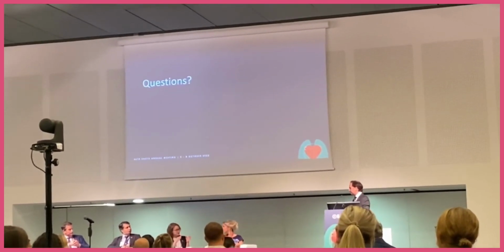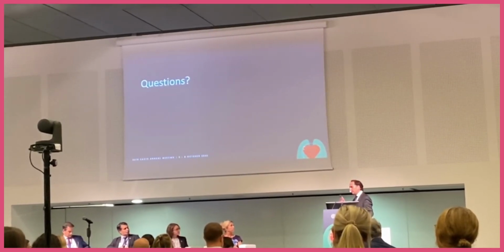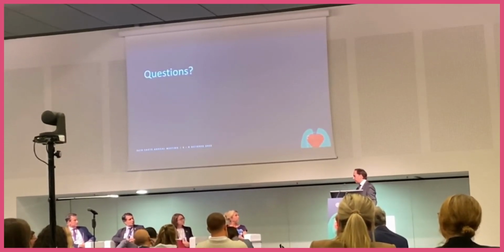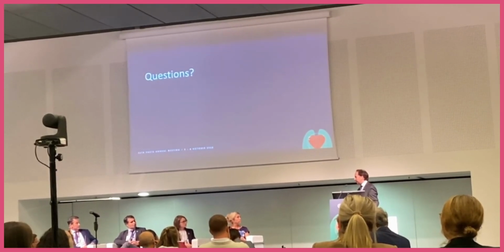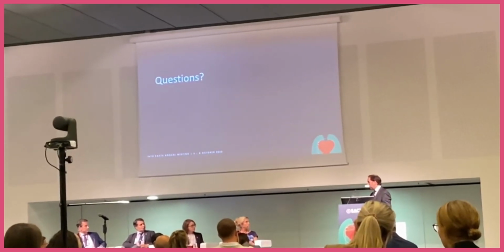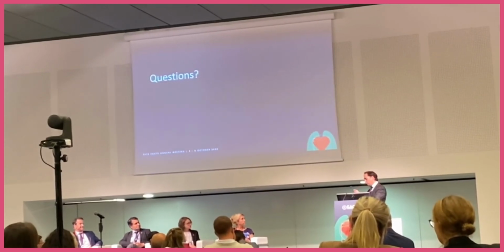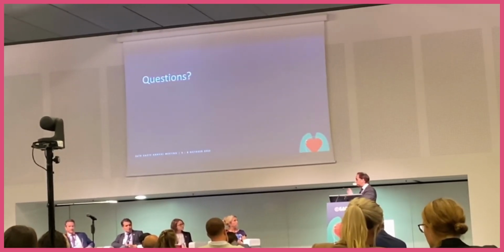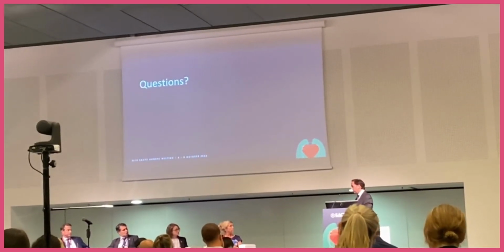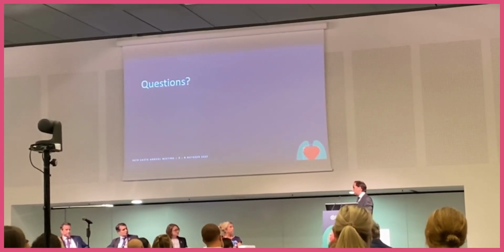Is there variability in the size, or is there a minimum vessel size? Yeah, that's a very good question. So in this trial, we started with a small clip. It's actually aimed for diameters of 1.2 to 1.7 millimeters. That's also why we targeted either diagonals or distal LAD. There's another clip, a larger size clip, which is aimed towards bigger size targets. I think the opening, the solid opening, is 2 millimeters, standardized at 0.8, and because of soft remodeling on the inside of the vessel, it can expand a little bit. But it's aimed for smaller size targets, and there will be multiple clips for larger size targets.